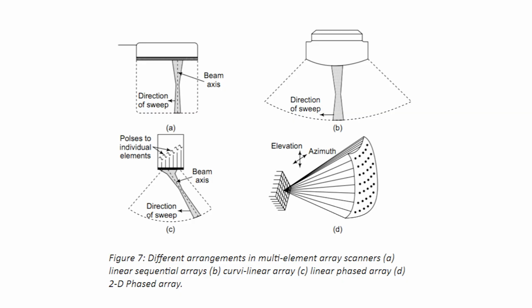Linear array transducers are available with 512 elements in currently available ultrasound scanners. Generally, up to 120 elements are selected at a time for the operation. As is obvious from the diagram, the field of view with a linear array arrangement is limited to the rectangular region directly in front of the transducer.